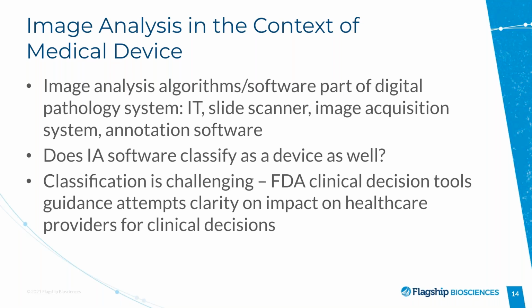And here, I'm touching a little bit on what David was mentioning. Now one would have to resort to maybe a clinical outcome measure as a true validation of this assay. So the regulatory pathway involved in this kind of decision may indeed be very complex, even after one has dealt with the complexity necessary to analytically validate this assay. And I would be happy to take questions if we want to go into more detail on what it takes for the analytical validation of this digital assay.